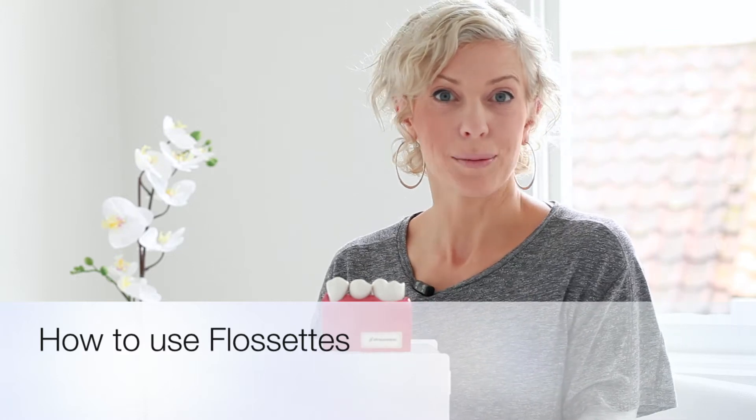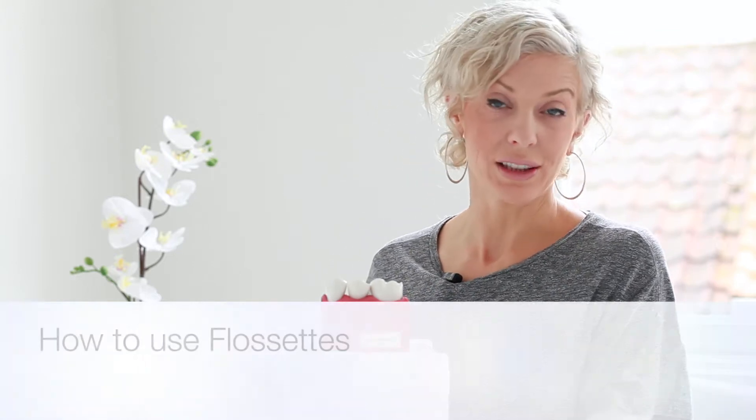Hi, I'm Andrea Ubee and I'm just going to show you really quickly how to use a floss set to clean between your teeth. Some people don't like floss, some people don't like using interdental brushes, but floss sets are another way of cleaning in between. We need to clean in between the teeth because otherwise just brushing never gets between, and that's where we get a lot of decay and gum disease.